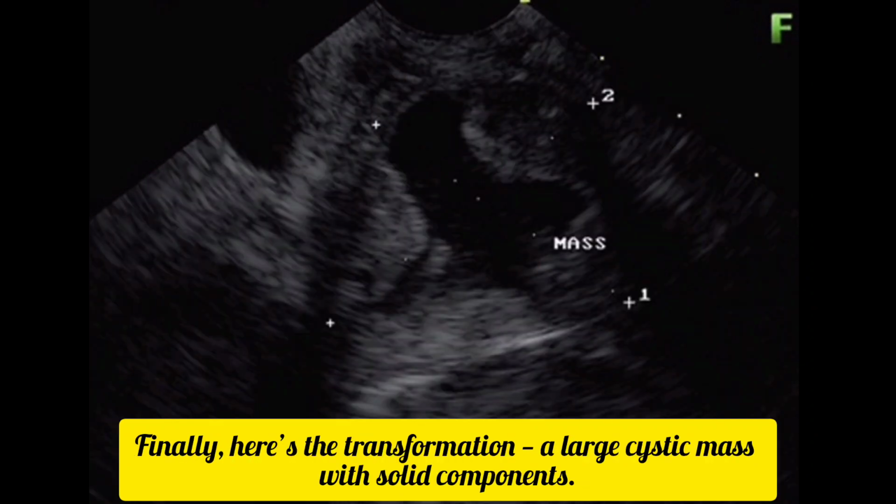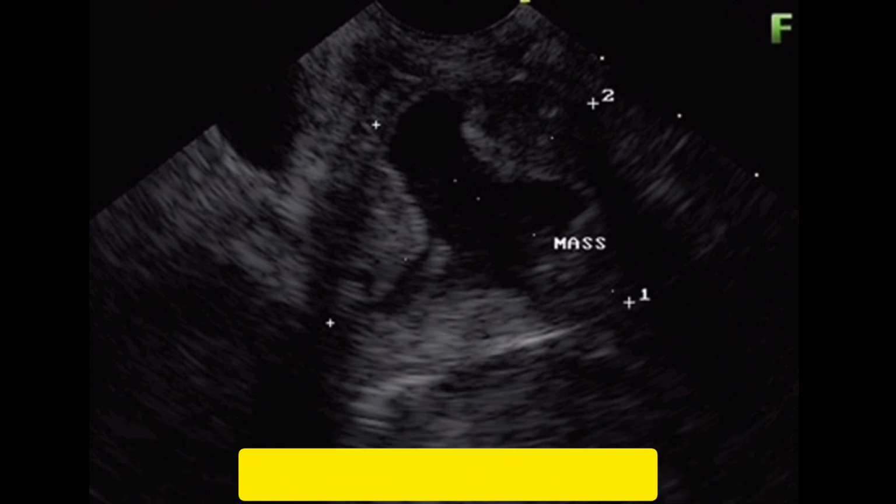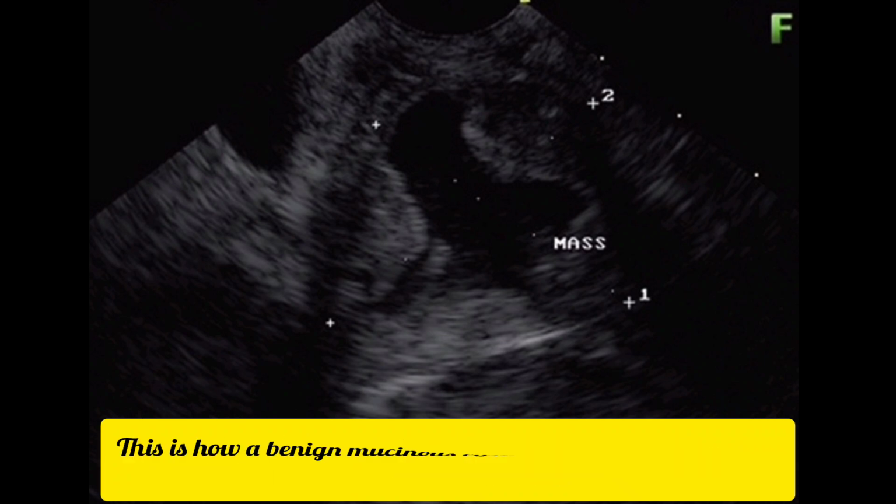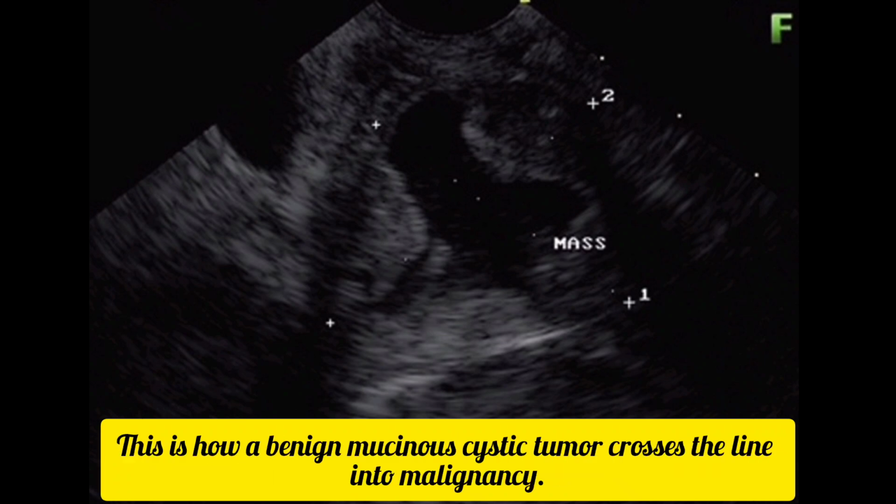Finally, here's the transformation. A large cystic mass with solid components. The cyst fluid had high CEA levels, and the FNA revealed malignant cells. A mucinous cystadenocarcinoma. This is how a benign mucinous cystic tumor crosses the line into malignancy.